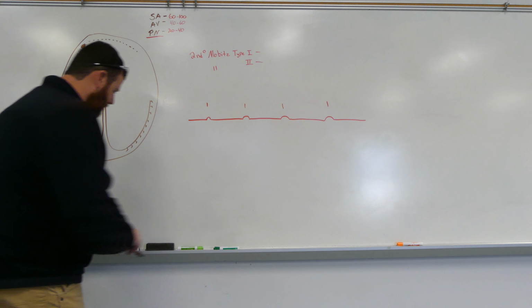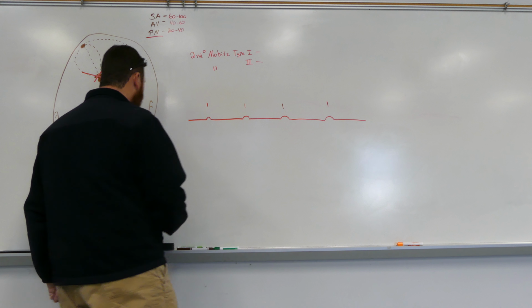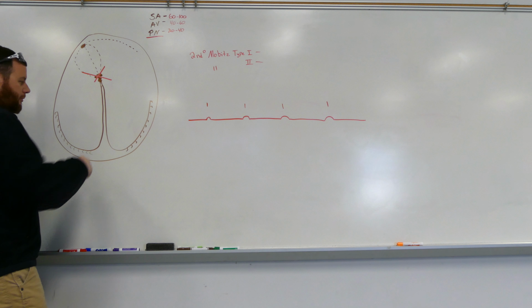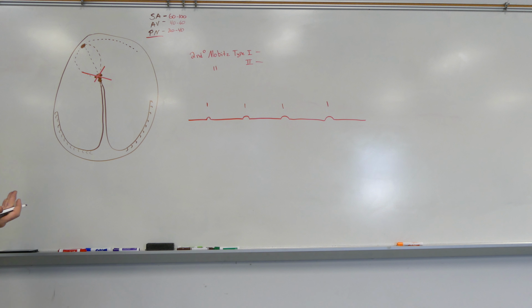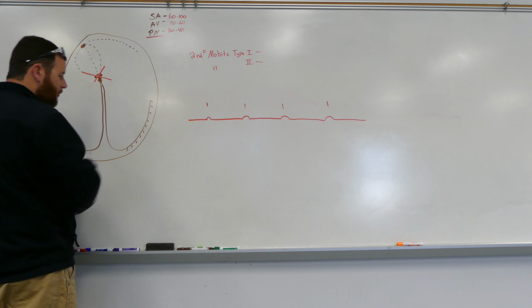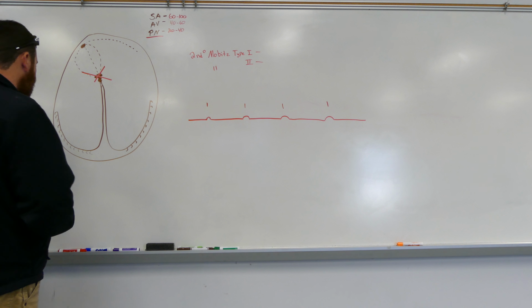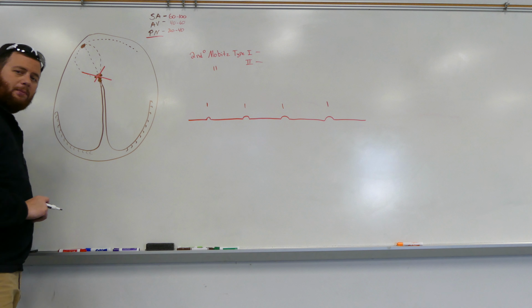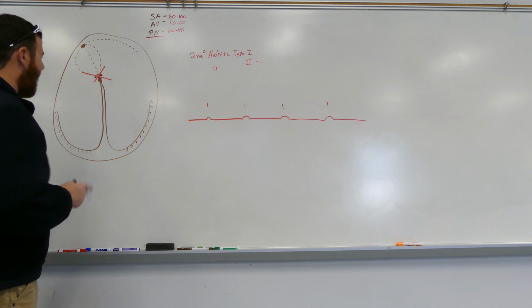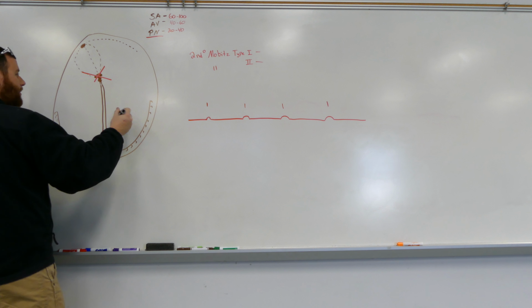So, when we have a ventricular complex, a complex which originates in the ventricle, similar to that of a PVC or a VTAC that we learned a couple of weeks ago, then we learned that the complex normally is wide. It's normally greater than 0.12 seconds or 120 milliseconds. And that is true most of the time with a third degree AV block, but it doesn't have to be, because it depends on where in the ventricles this pacemaker site originates.